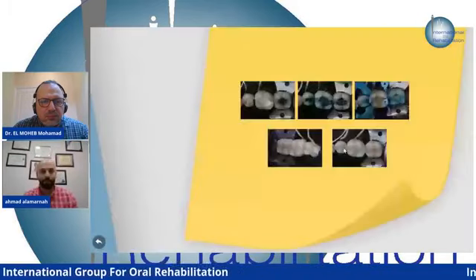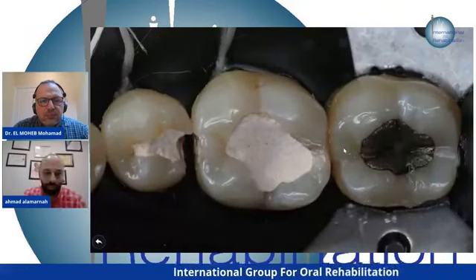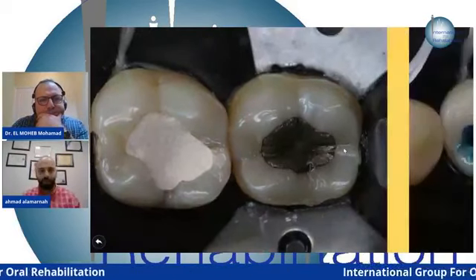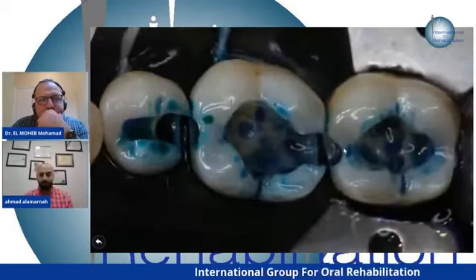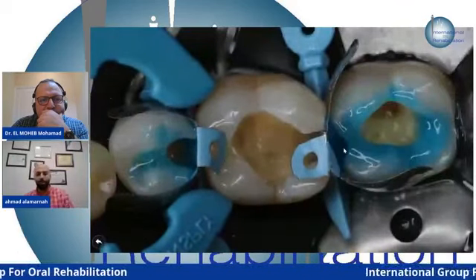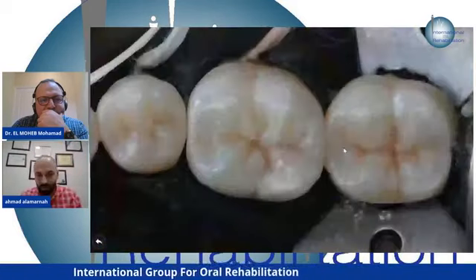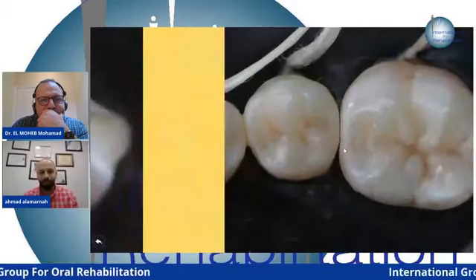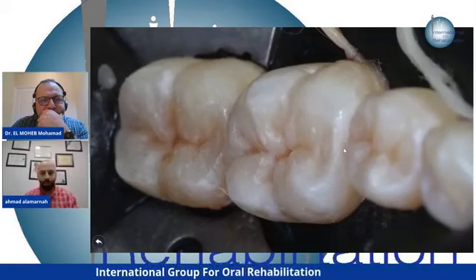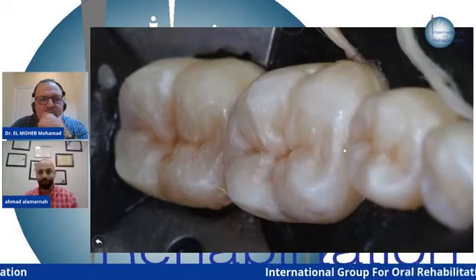Let's see some pictures. All the cases in this presentation are for doctors. This case is the 5, 6, and 7. This is after the removal, and I did my caries indicator. And this is the total etch and the selective etch. And this is the final result. Look at the depth of the cusp, the coloration. I will show it to you next in the bracket part.